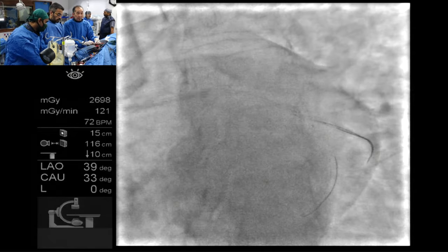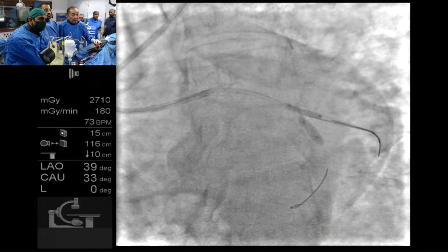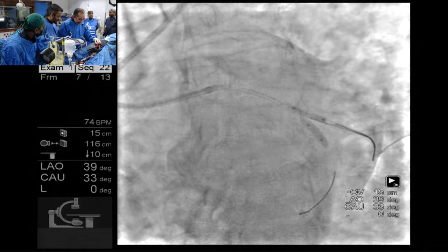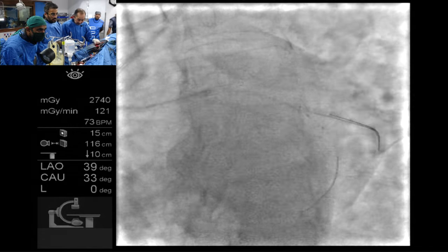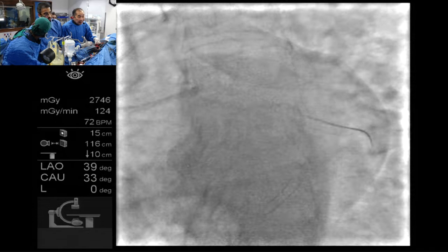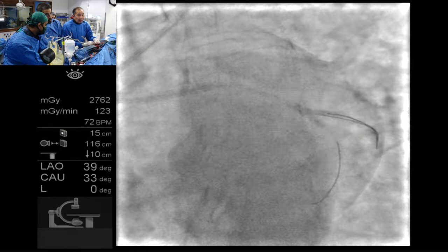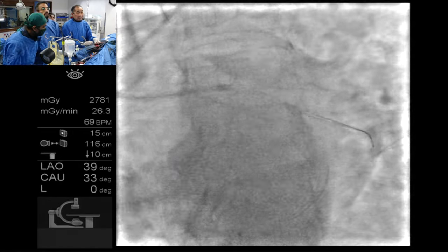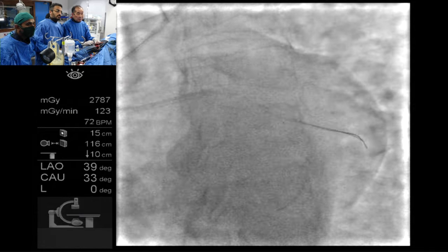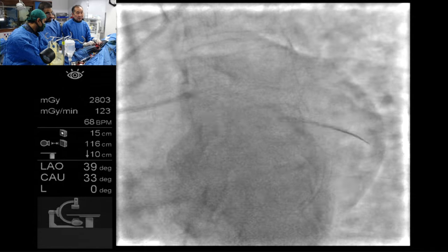Get a kissing. Go to 12 atmospheres each. Same pressure, both sides. Okay, go together. 2, 4, 6, 8, 10. 12. Okay, done. I think we should be okay. Do one more here. Go faster. 2, 4, 6, 8. You slip down always. Okay, done. Not a good kissing, huh?